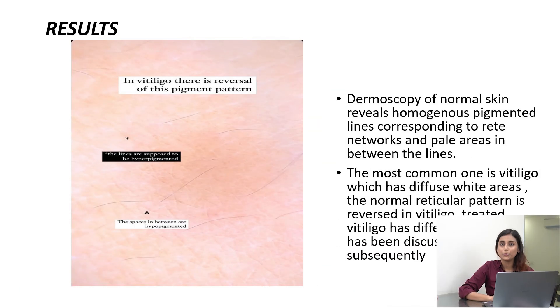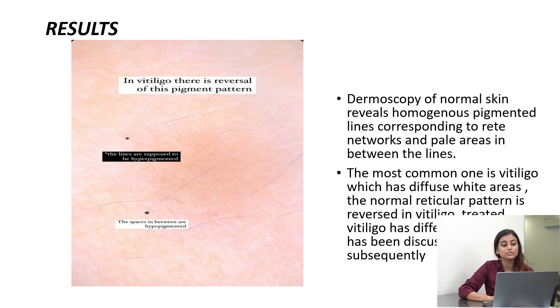The first image we see — I'm going to be discussing a few dermoscopic images. In case of normal skin, you have exaggeration of skin pigmentation at the areas where you have skin markings, and in between the skin markings you have hypopigmentation — relative hypopigmentation in between and hyperpigmentation around them. But in vitiligo, this pigment pattern is reversed. That is called reversal of the pigment pattern.